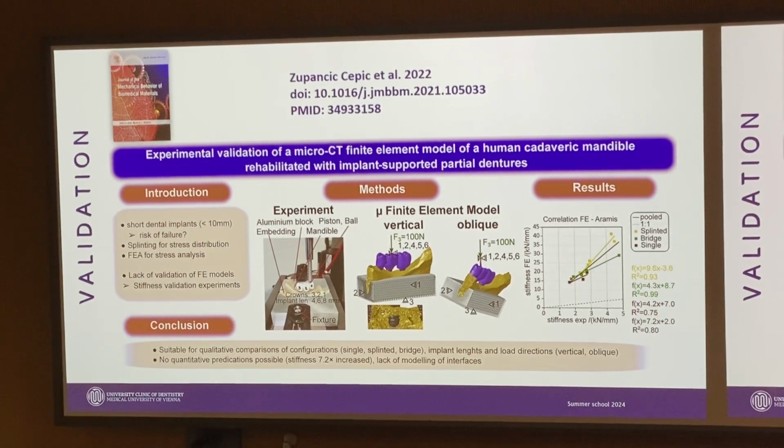Altogether, 18 different configurations were loaded in a static manner, axially and eccentrically at 100 Newton, and the resulting displacement of the bone implant prosthesis complex was recorded using an optical deformation tracking system to calculate the overall stiffness.